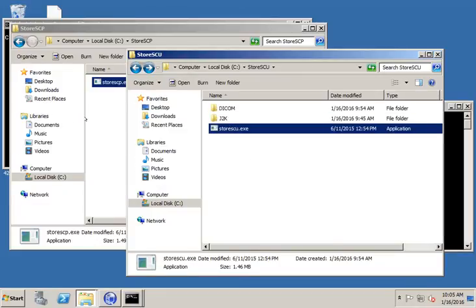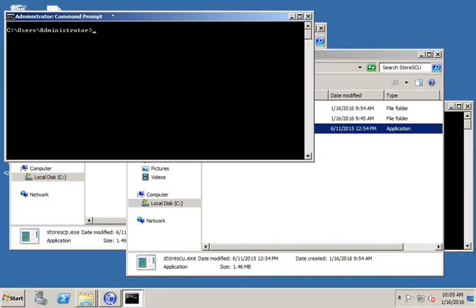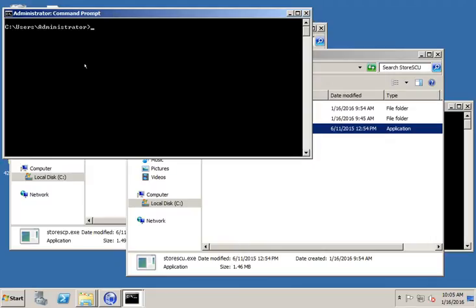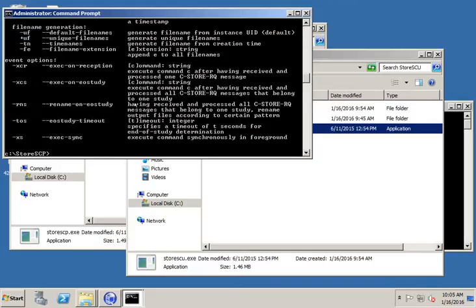So the first step is we have to set up our listener. I have a command prompt running up here. First I need to change directory to my directory that I created, so it's going to be C colon backslash storeSCP. So now I'm in the directory that has storeSCP. The command to start storeSCP is storeSCP. If you want to see the options that are available, you can just hit enter and it'll display all the options.